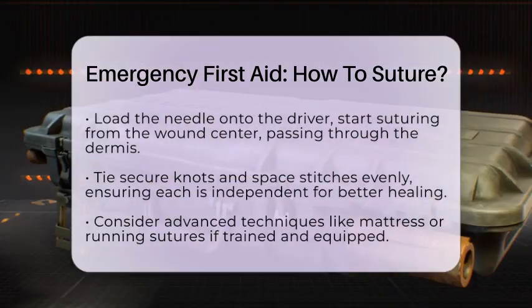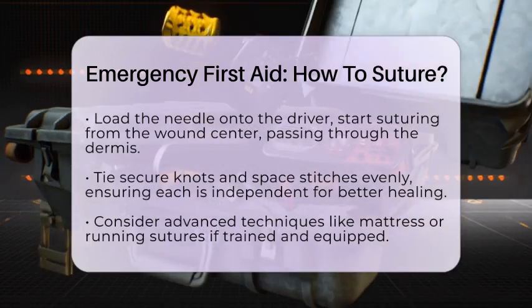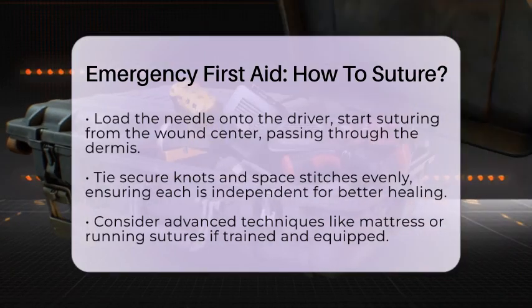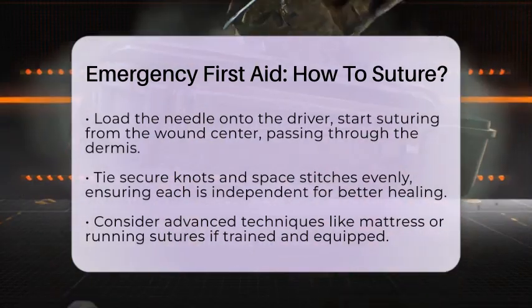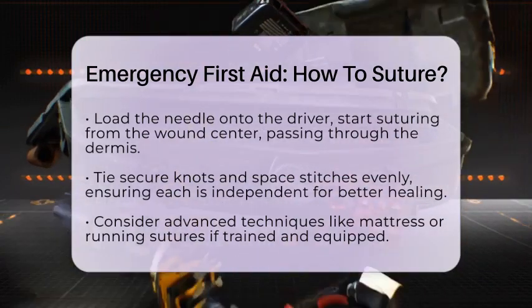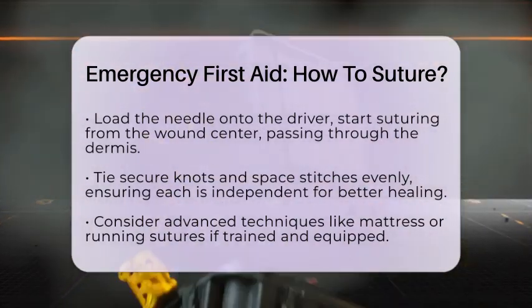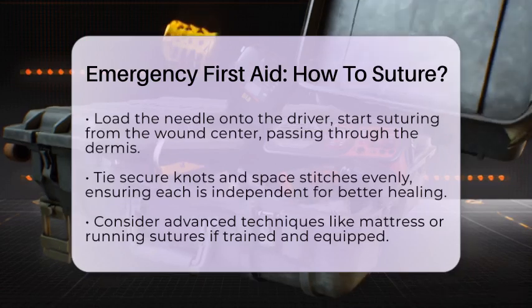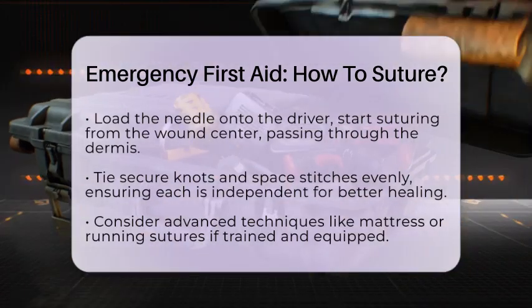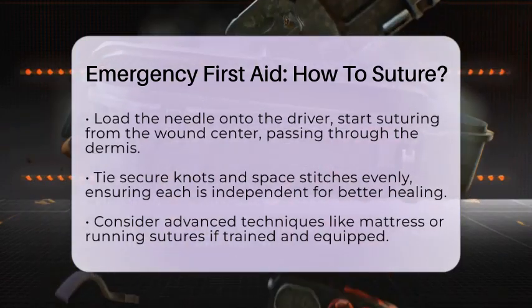Reinsert the needle on the opposite side, mirroring the entry point, and pull the thread through without pulling the entire suture out. Tie a secure knot by wrapping the suture around the needle driver and pulling tight. Cut the excess suture, leaving a small tail. Repeat this process with stitches spaced evenly along the wound. Each stitch should be independent to allow for better healing and infection control.